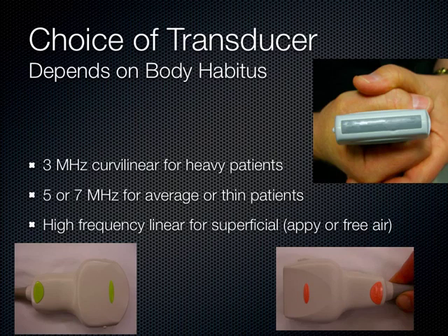So when you look at the bowel intestines with ultrasound, like everywhere else in the body, you want to try to use the highest possible frequency so you get the best possible resolution, as long as you can penetrate to the depth of interest. And so usually on most patients with the bowel, like for appendicitis and stuff, we use this linear probe. That gets us our answer almost all the time, which is great because it's high frequency. Though occasionally we have to use the lower frequency curvilinear probe, down in that 3 megahertz range. In a larger patient, we have to turn to this transducer sometimes, but almost always I can get by if I push hard enough with the linear transducer. We get really nice images.